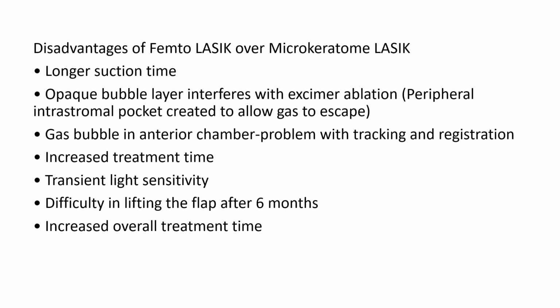A few disadvantages of femto LASIK over microkeratome LASIK include that in femto LASIK there is a longer suction time, and the OBL, that is the opaque bubble layer, can interfere with the excimer ablation. There is transient light sensitivity and an overall increase in treatment time.